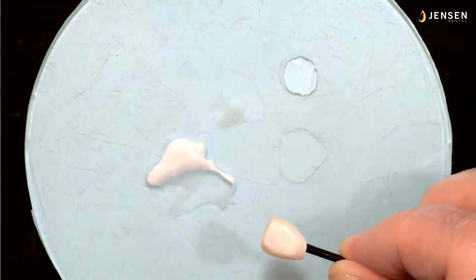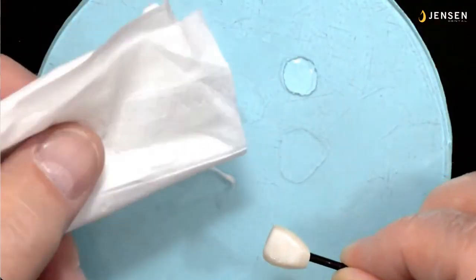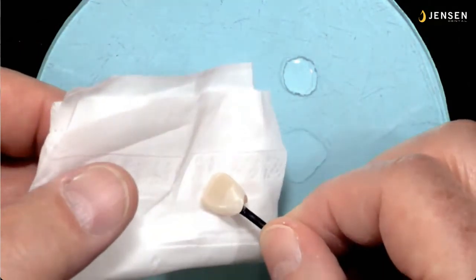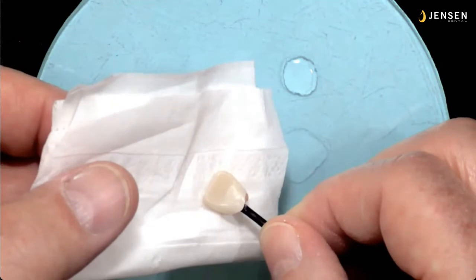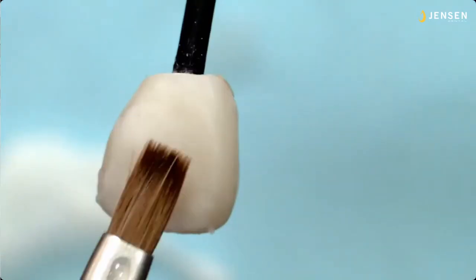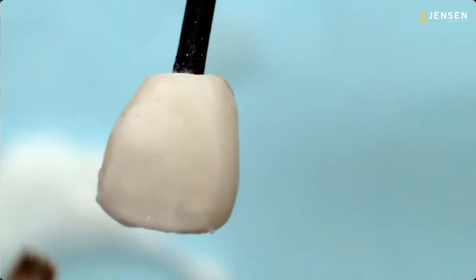I use a flat brush with a little bit of water in it to push them together. And then I finish off with the little pieces for repairs and fixing up and adjusting for contour. Again, it was getting really, really wet because I'm applying it with water. So here I've blotted it. There's that flat brush I was telling you about.